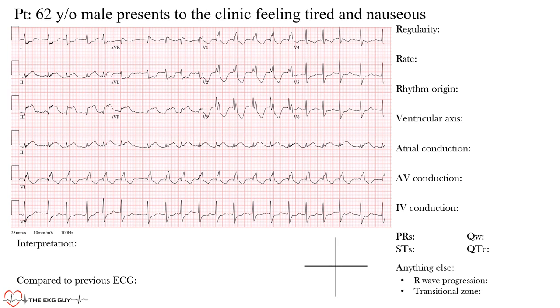Looking at lead V5, one of our rhythm strips, here's the R wave and here's the next R wave. From one R wave to the next, we call that the R-to-R interval. As you can see, these R-to-R intervals are different — most of them are not the same, meaning this is an irregular rhythm. Not only is it irregular, but there is no regularity whatsoever, so we call this an irregularly irregular rhythm.